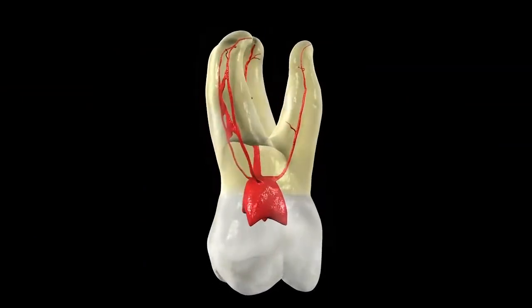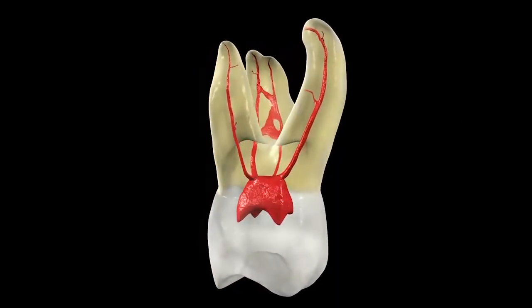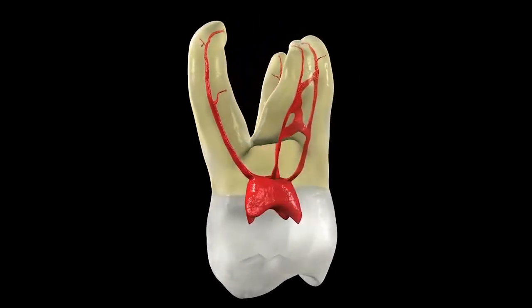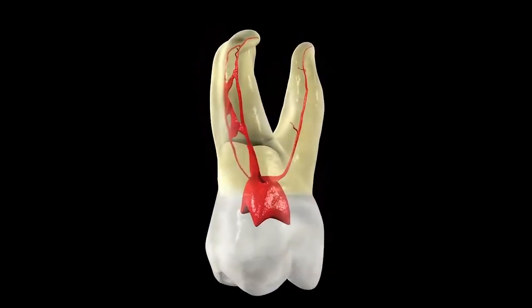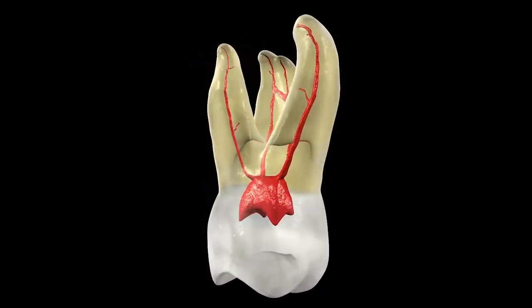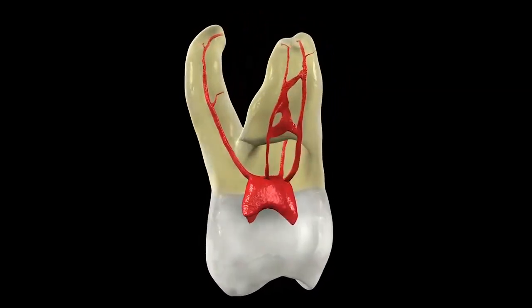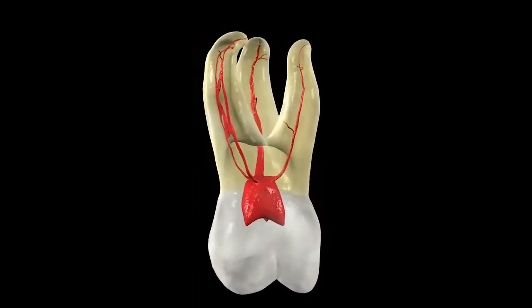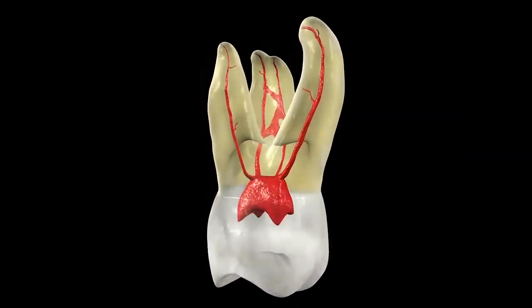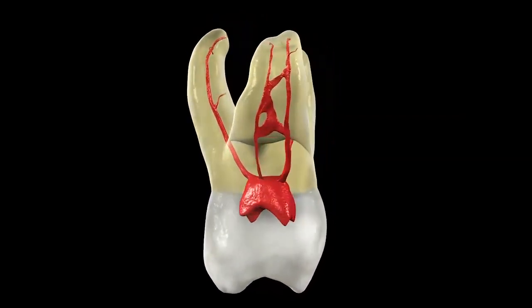Today's episode on canal preparation will be conducted on this maxillary animated molar. The reason we're going to use an animated molar is so we can be very clear and visually see the work that's done inside the canal regarding dentinal debris, mud, and how the shaping progresses right down to the final preparation. The maxillary molar tooth is the most frequently researched tooth in the mouth — it's the largest tooth by volume — but it's probably the most misunderstood tooth, leading to many misunderstandings during endodontic treatment.